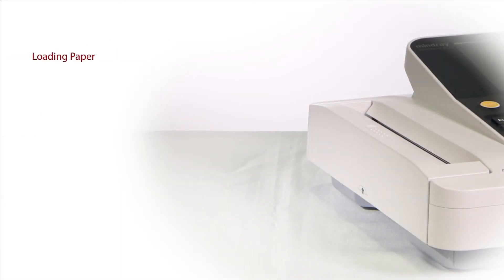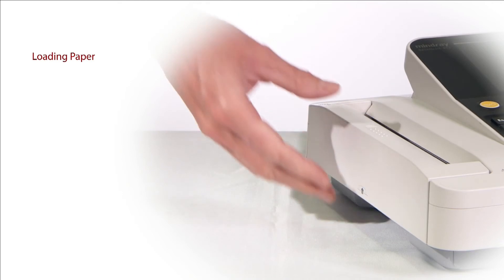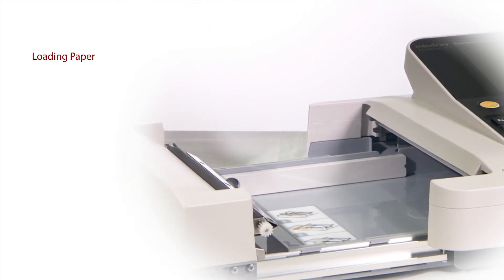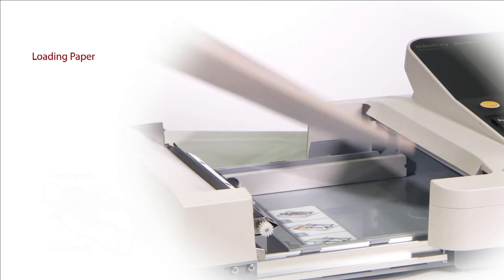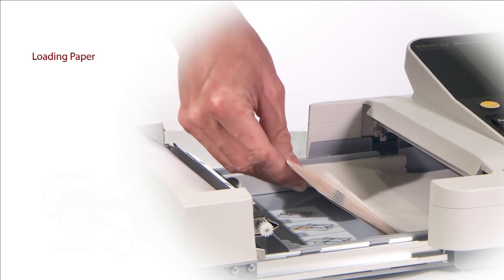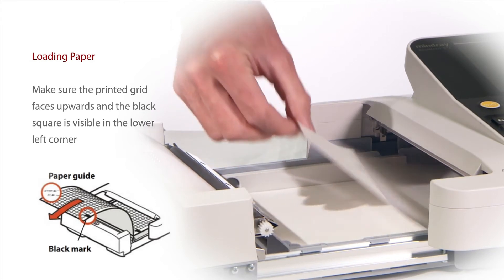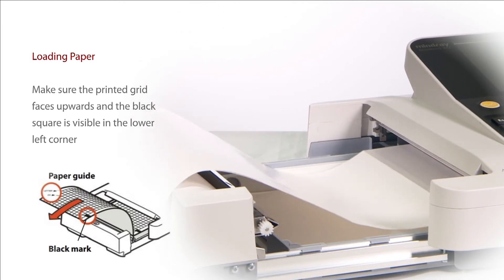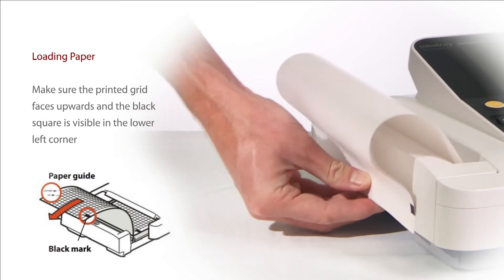To load ECG paper, open the paper tray by lifting the lever underneath the tray. Place a ream of Mindray ECG paper into the tray. Flip back the top sheet of paper so the printed grid faces upwards and the black square is visible in the lower left corner. Align the paper with the markers and firmly close the tray.